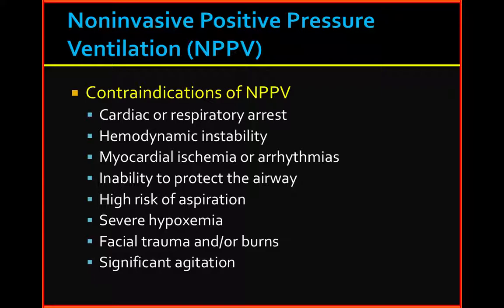Many of you are familiar with or have heard of the concept of CPAP. CPAP is continuous positive airway pressure applied to a non-intubated patient via an external face mask. CPAP is the same as PEEP, except CPAP is applied via face mask and PEEP is applied via an endotracheal tube. I'll be honest, I don't think I ever learned that concept in school.